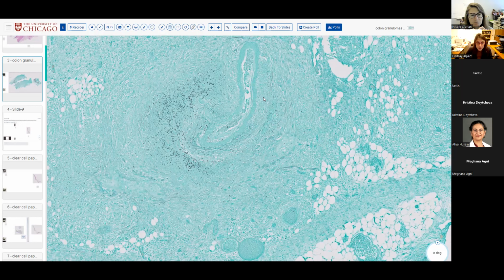But yeah, I've never seen another case where they had transmural involvement with perforation. I think that is pretty unusual, and I'm not exactly sure why he developed it, because obviously we see a lot of patients who are on these medications and live in these endemic areas who don't develop disseminated histoplasmosis.